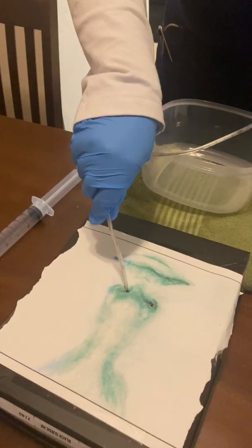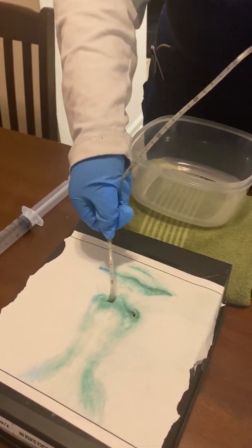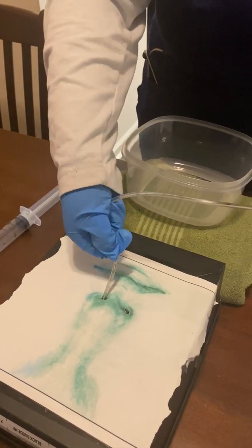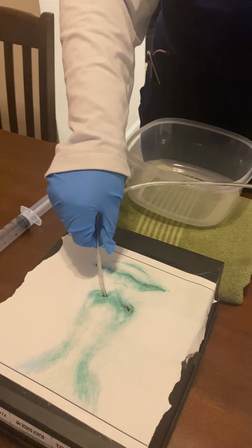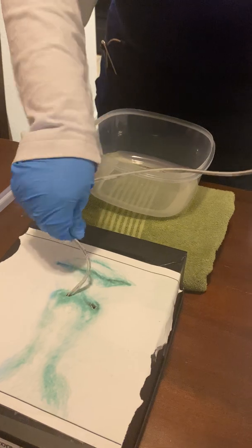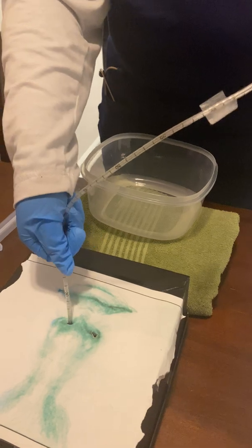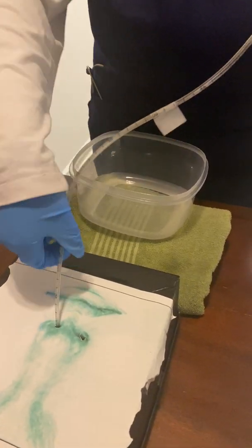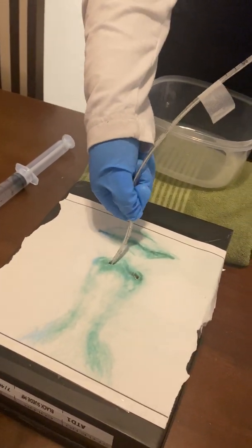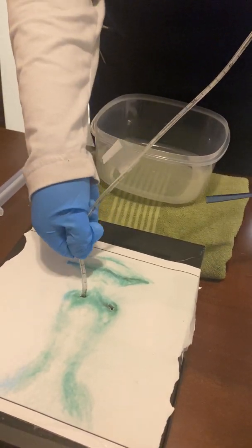Once I reach the nasopharynx, I'm going to tell them that they can relax and that they can either dry swallow or take a sip of water with the cup that I have placed there. And then I'm also going to state that if the patient begins to cough or shows any signs of respiratory distress, then I would stop and reposition my tubing into the posterior nasopharynx until they become stabilized.